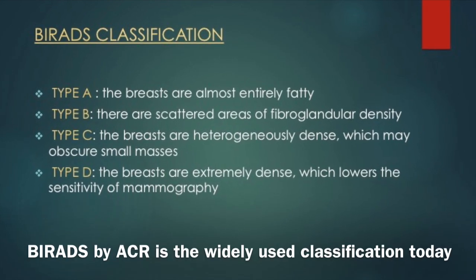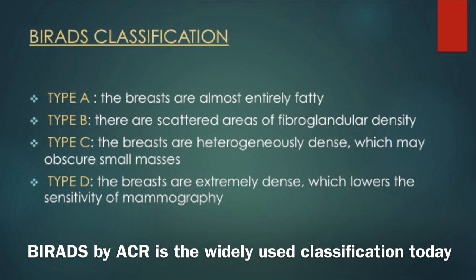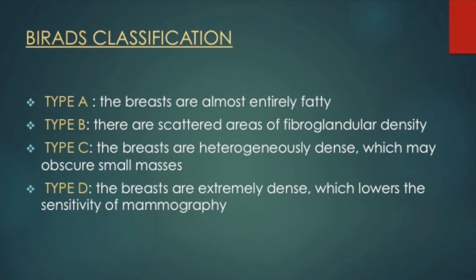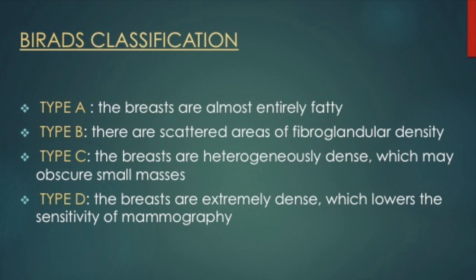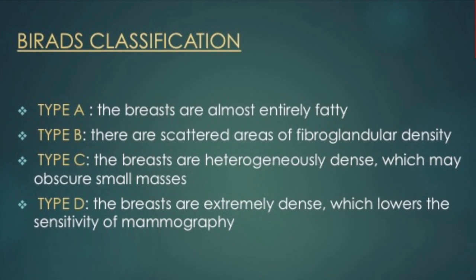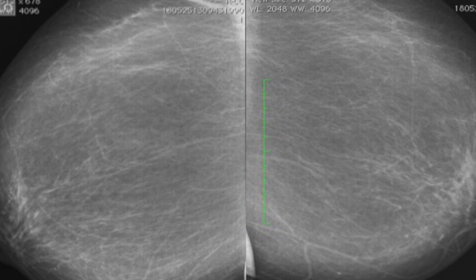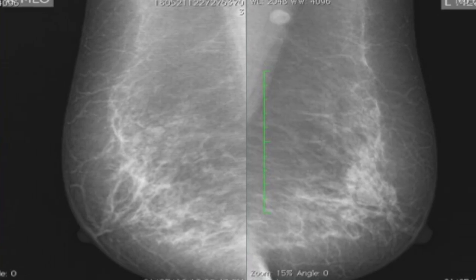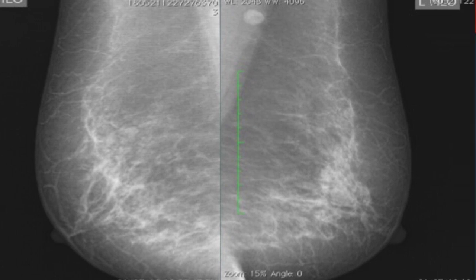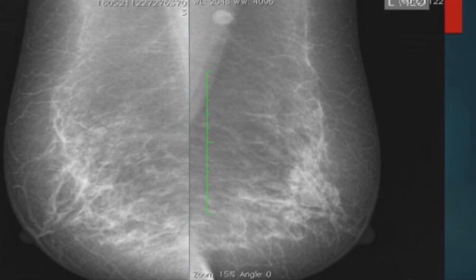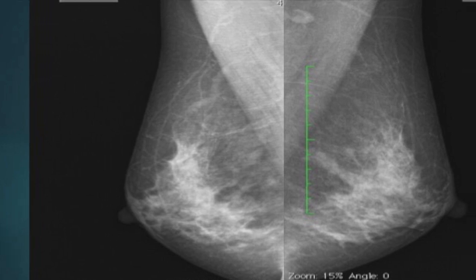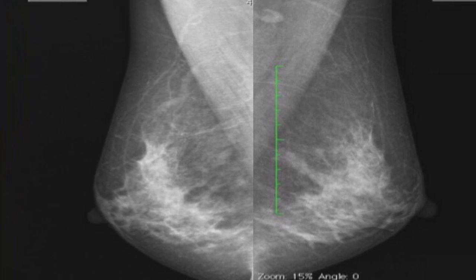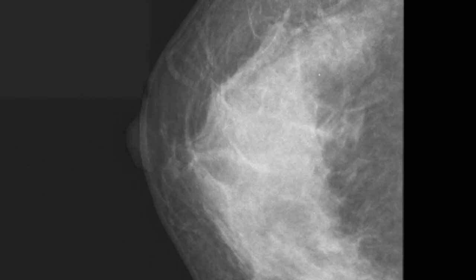The BI-RADS system was proposed by the American College of Radiology and is used worldwide in clinical radiology. It is a modification of Wolf's classification and has four main categories. Type A includes breasts which are almost entirely fatty. Type B includes breast tissue with scattered areas of fibroglandular density. Type C includes heterogeneously dense breasts which may obscure small masses, and Type D includes extremely dense breasts which lowers the sensitivity of the mammogram.